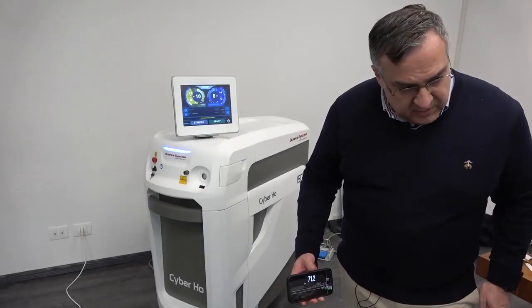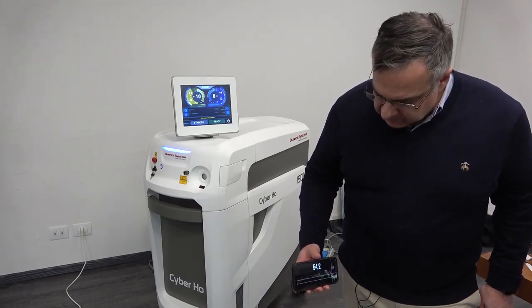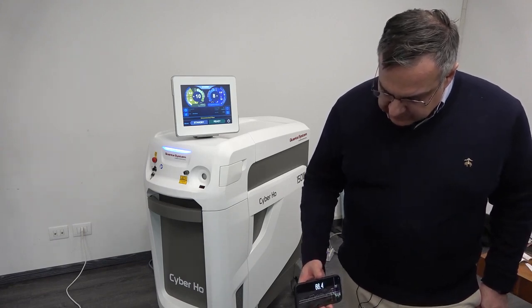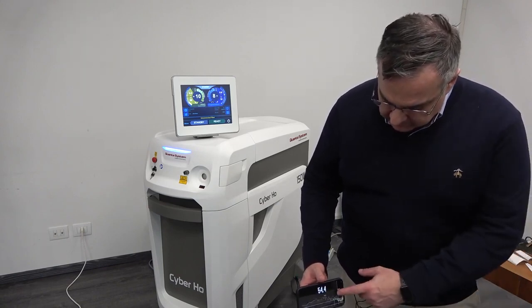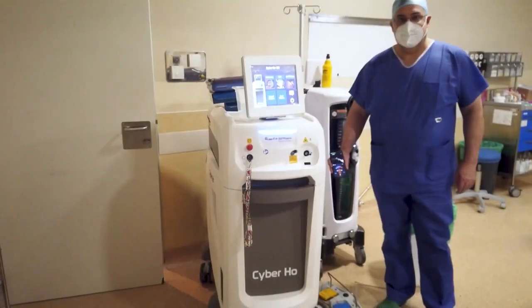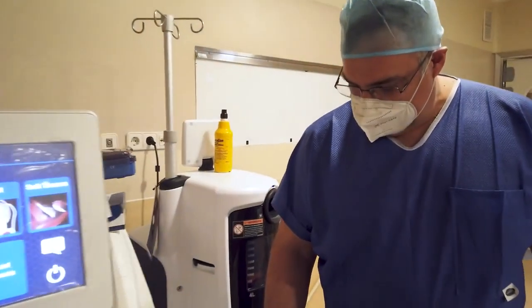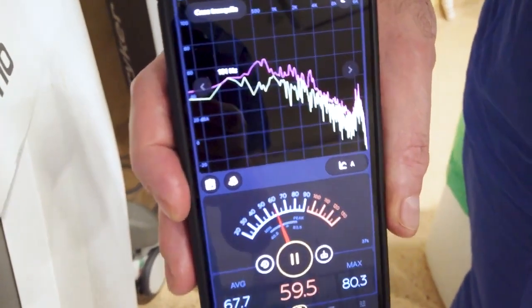Using a phone app to measure noise, Fernando demonstrates that the laser is extremely silent — the noise level barely registers. The same measurement is repeated in the actual operating room, confirming the laser is quite silent in real surgical conditions.